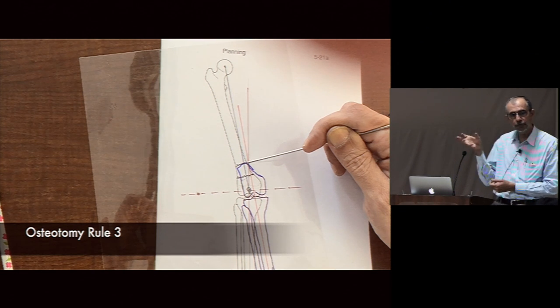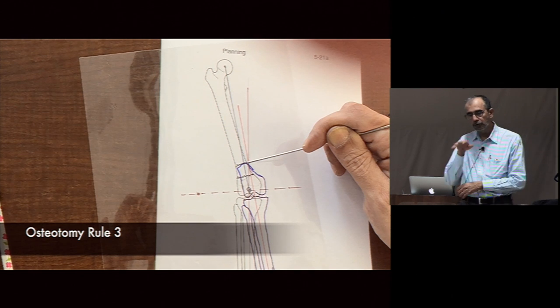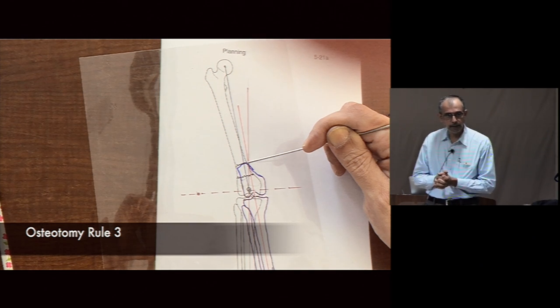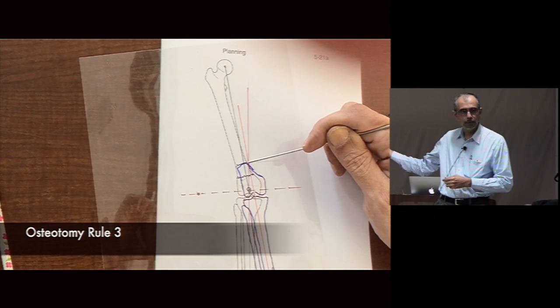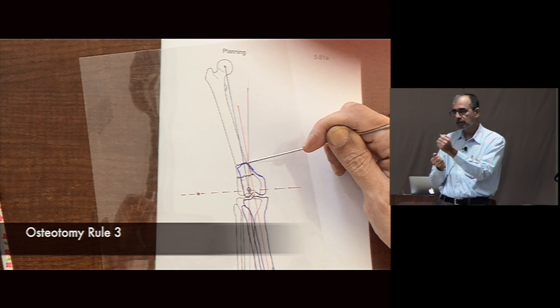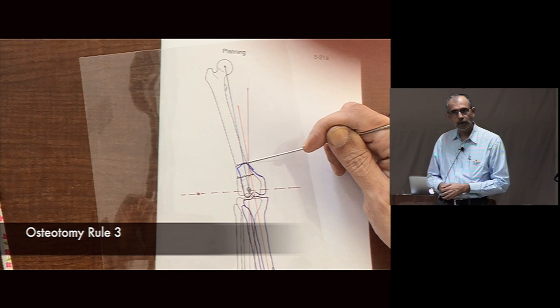Now suppose you fixed it, or you put your blade plate or you put your DCS, and now you do not know what is to be done. Now you know. What do you have to do? You just have to, what? Translate it a little, right.